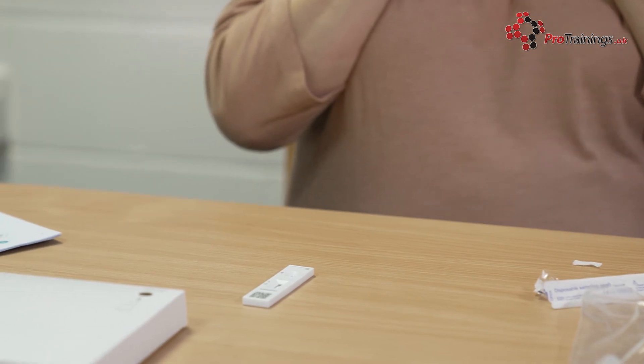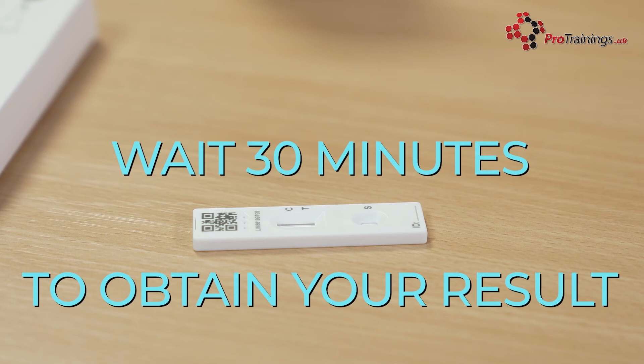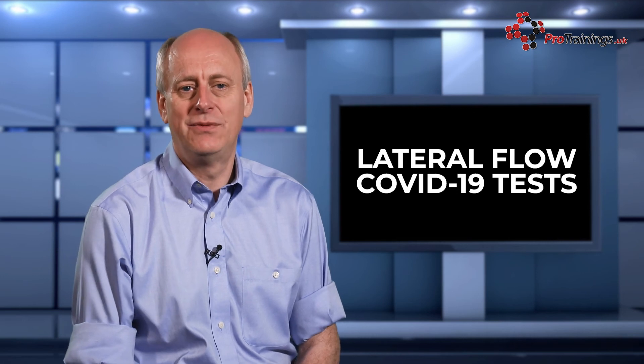Make sure the test strip is on a flat surface and do not move it during the test. Give the sample 30 minutes before you read the results. Waiting 30 minutes is very important — a positive result can show at any time after 20 minutes, but you must wait the full 30 minutes to show a negative result.